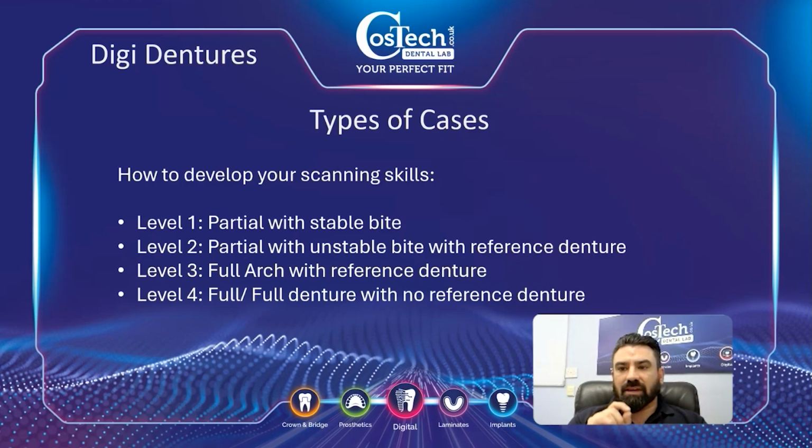If you have an edentulous patient, they have a denture, but you need to do a reline. Do a chairside reline just with putty, wash or something, and put it in the denture, and then afterwards just clean it up and scan it with that. When we're taking the denture on the computer and then the actual scan of the soft tissue, it matches a lot better. If you've got somebody who has a very ill-fitting denture, definitely take a wash in it first. It just means that the matchup is even more accurate.